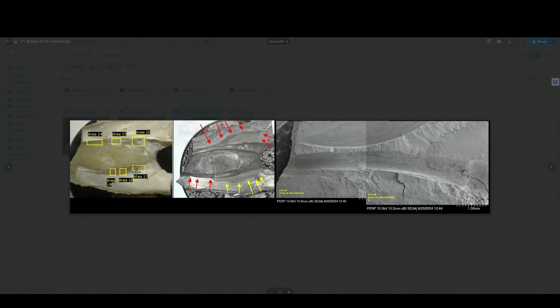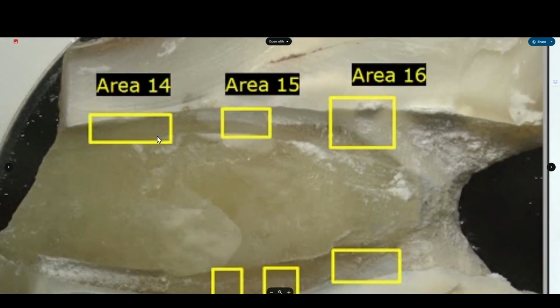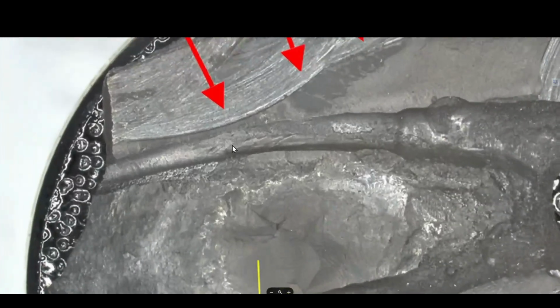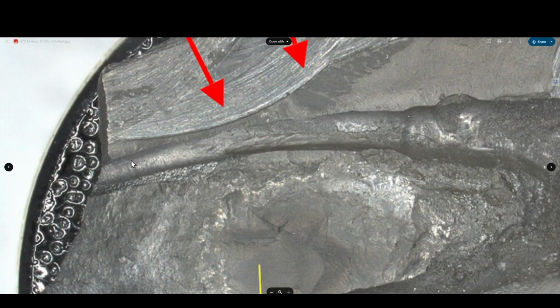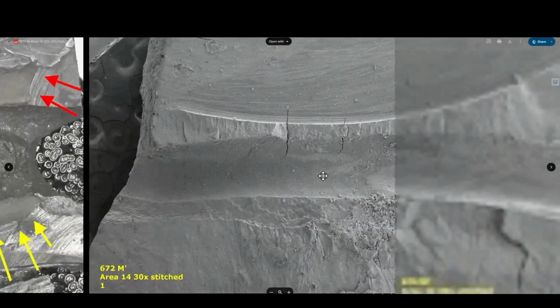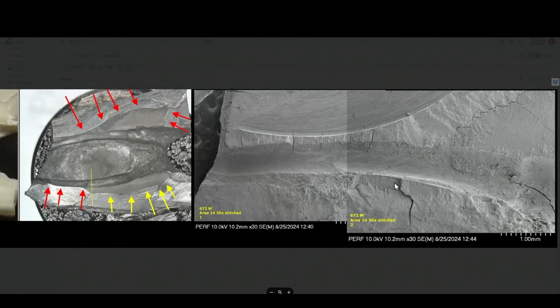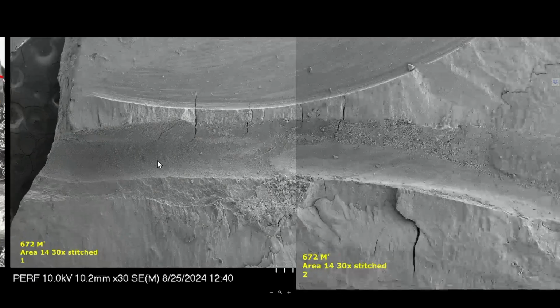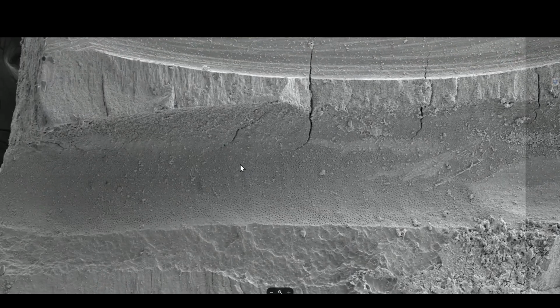When we look at area 14, we come in here. This is the area we're going to be looking at, and you can see that the sectioning disc has not affected this area. When we look at the survey section, this is what it looks like. You can actually see where Reed's instrument created the smear layer. This area of the canal, I believe, was never instrumented, or it doesn't appear to be. And when you look at the dentin wall, it has that Gentle Wave appearance of open dentinal tubules.